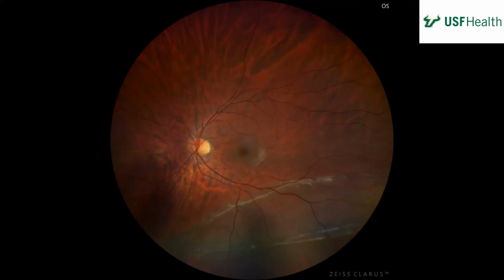And what are these lines? Do you guys know? They have a name. Demarcation lines? So that's a demarcation line. Does anybody know about how long it takes to get a demarcation line? I've always read it takes about 3 months. So things have to hold still. It's like a seaweed line. So that means it's stopped here, moved, stopped, but now it's maybe moving a little bit more. That's why that little edge is of some importance.